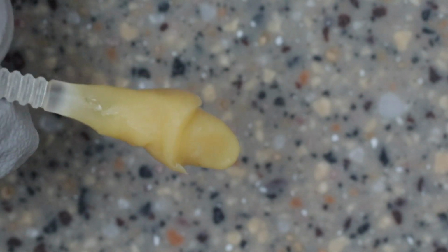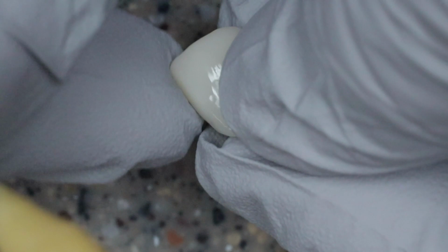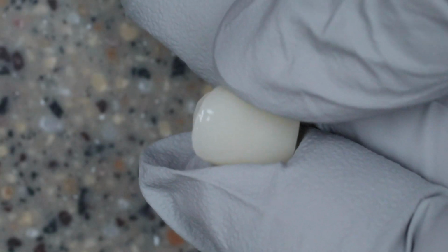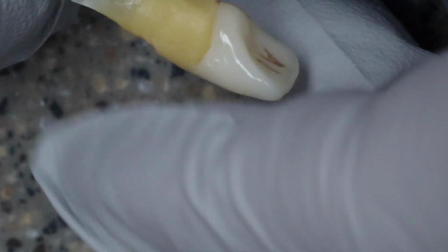Now there are some pros and cons to this. A pro would be, we're using the material that we're planning on restoring with, right? A con would be if you're doing this, you have to know the prep shade so you can use the natural dye material to replicate that prep. So that means that you've already cut the tooth, and that means that the teeth are probably a little dehydrated. So that's going to be something you need to factor in as well. It could give you a little bit of a false representation if the natural teeth are dehydrated. But certainly this is a cool way of seeing what your final material is going to look like, because it's most closely replicating the natural teeth and using the restoration that you plan to use for your patient.